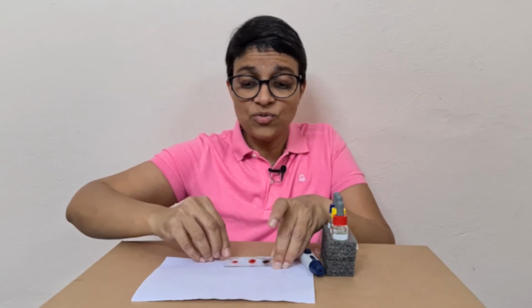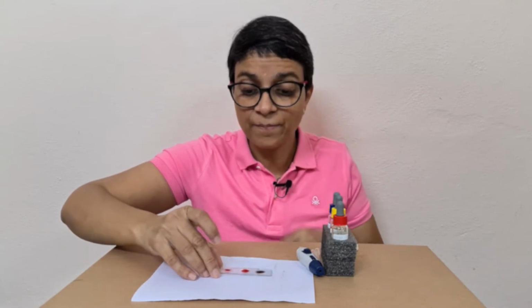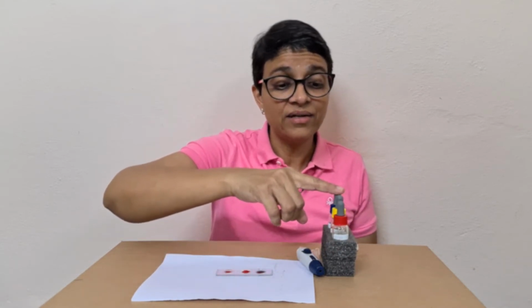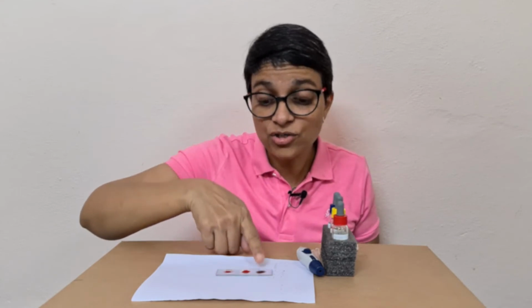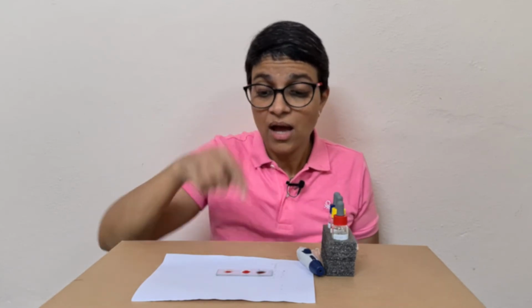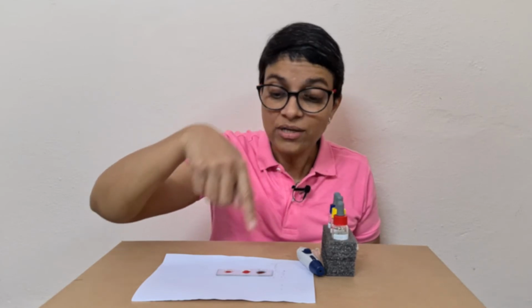That is why the visible clumping, it's almost getting dry. The clumping is seen like this. And when I added to my blood, I added antibody A. It did not show clumping, so I do not have antigen A. That is why there was no reaction. If I don't have the antigen, the antibody cannot react with it. I have B antigen, so therefore when I added B antibody, it showed a positive reaction. Therefore, I know I am B positive. So that's how we do the things.